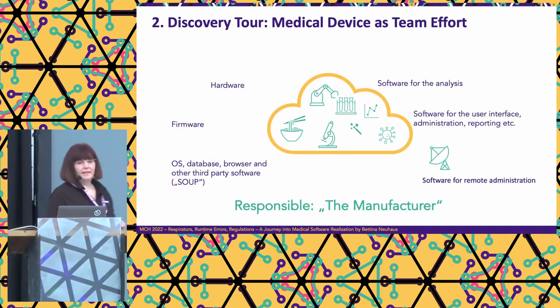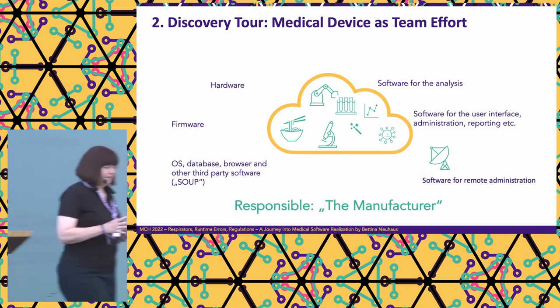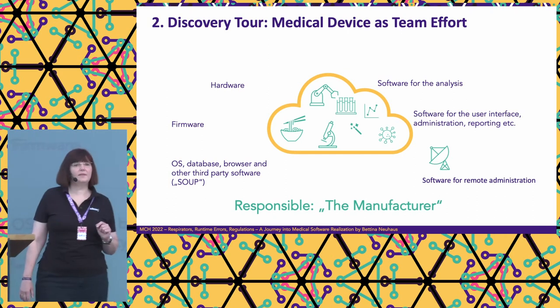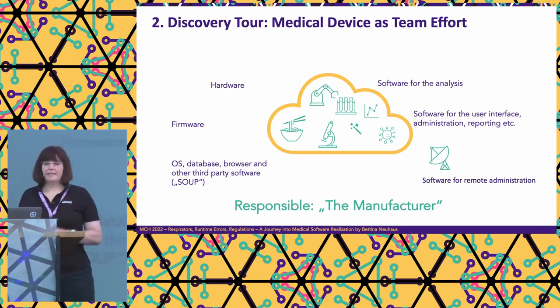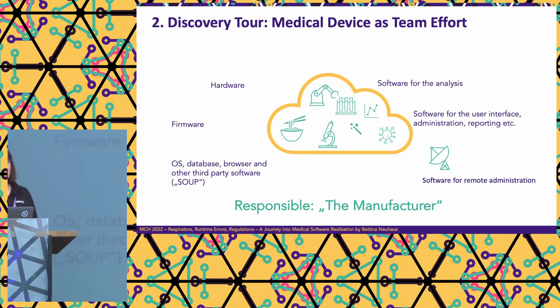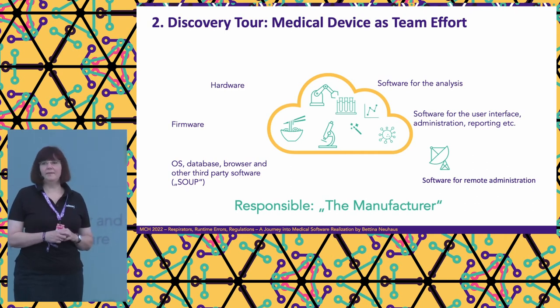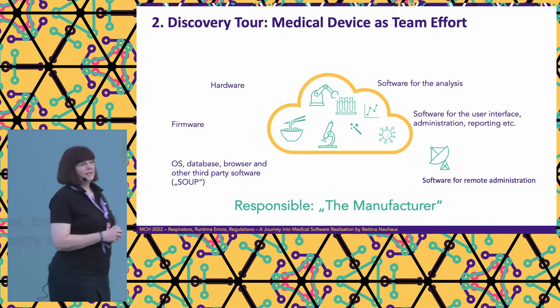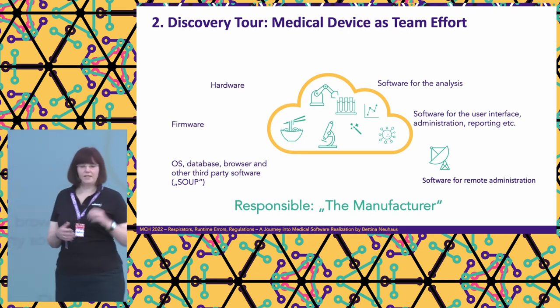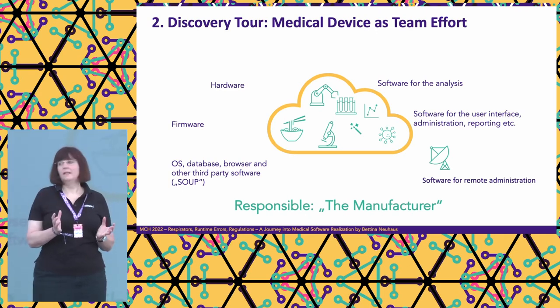Yeah, and then I want to bring to your attention, as IT people you will already know that, those medical devices comprise many parts, of course. Often you have a part of hardware, there you have the firmware, of course, the software for analysis, and so on. The example I've taken here is loosely based on a lab analyzer. What's important is that all of this can come from different suppliers, and they all need to comply. And who is responsible in the end? That's the manufacturer. That's the one whose name is on the packaging. And that's the one who tells the official agencies, here's the medical product I want to enter the market. And that manufacturer has to make sure that each supplier is compliant.